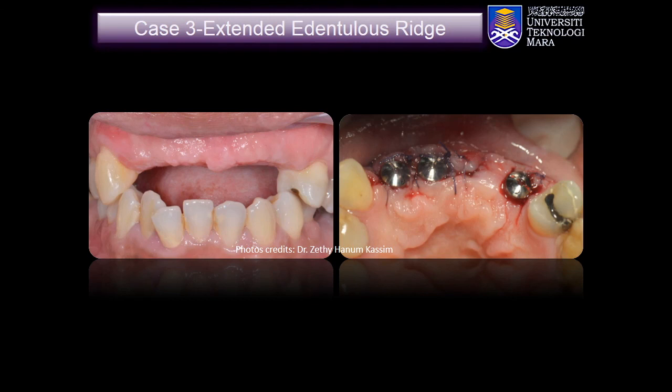This patient had lost her anterior bridge following an accident during an anesthetic intubation procedure, resulting in severe bone deficiency in the areas of teeth 1-2 to 2-3. The photograph depicts the anterior ridge following hard tissue grafting to increase the bone width for placement of regular size implants. The grafting and implant placement were carried out in 2 separate procedures.